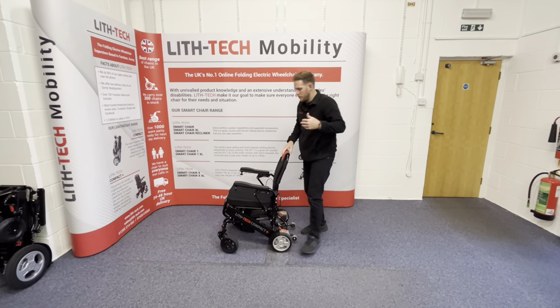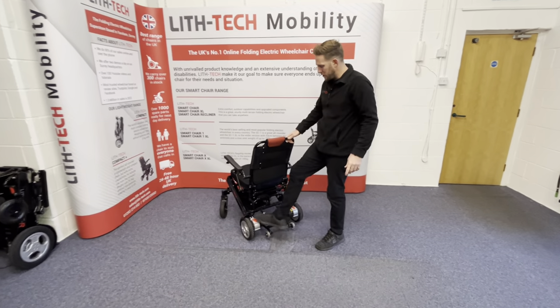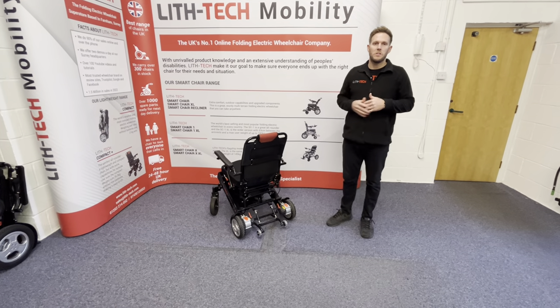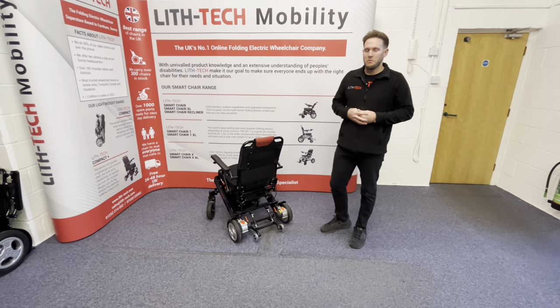Let's run through the components. We've got 180-watt brushless motors. Brushless motors are what you want — we don't sell a single model now with brush motors. All of our entry level models are gone and we're focusing on the best of the best. LITH-TECH want to be known for quality, capability, and comfort.